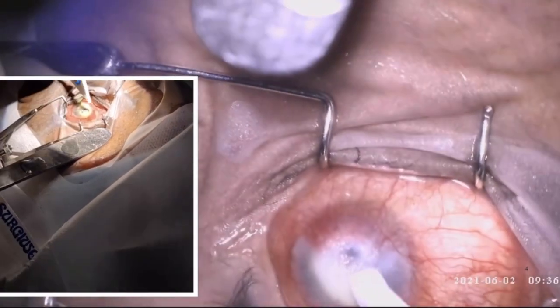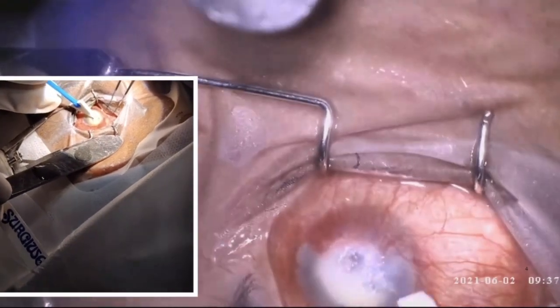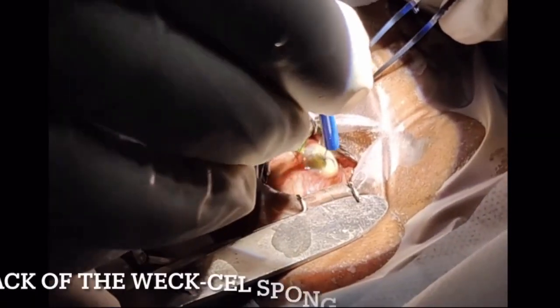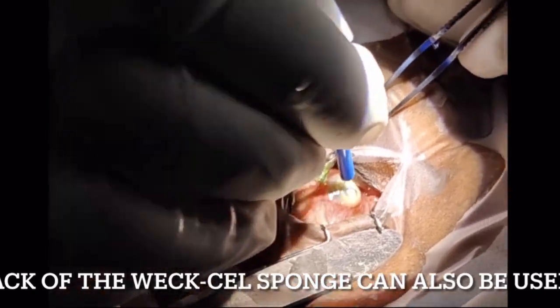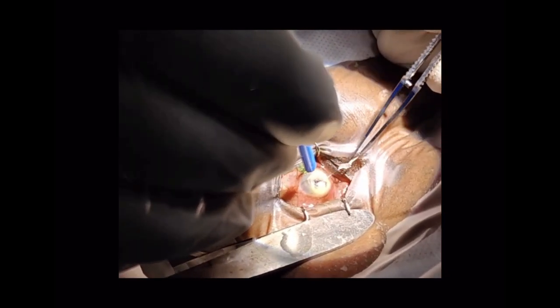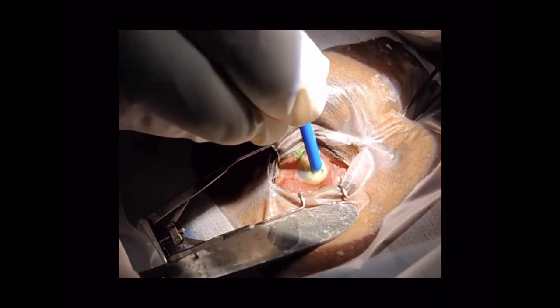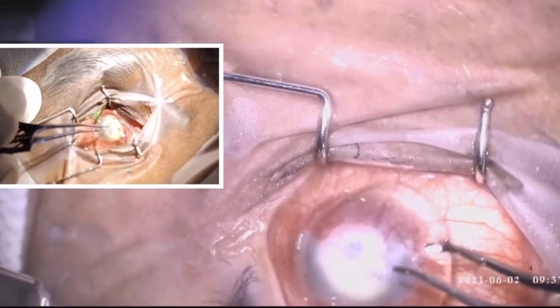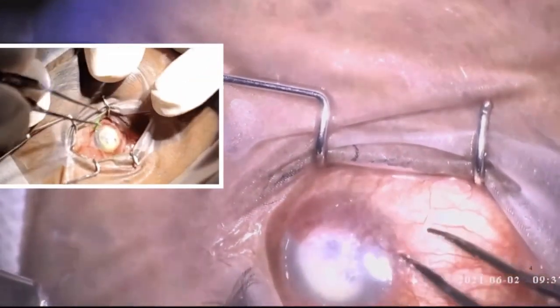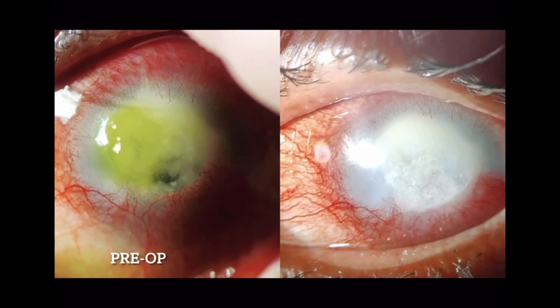Here we have used the apex of the Weck-Cel sponge to place a thin film of tissue adhesive. You can also use the back of the Weck-Cel sponge for tissue adhesive application. So after the TA application is over, the BCL is placed over the surgical area.